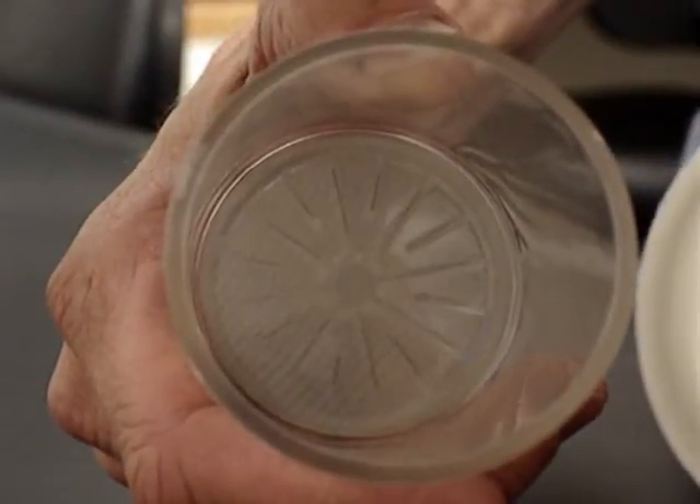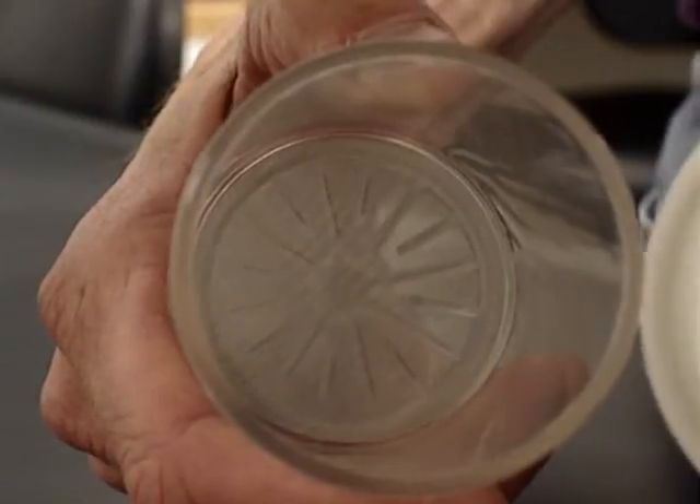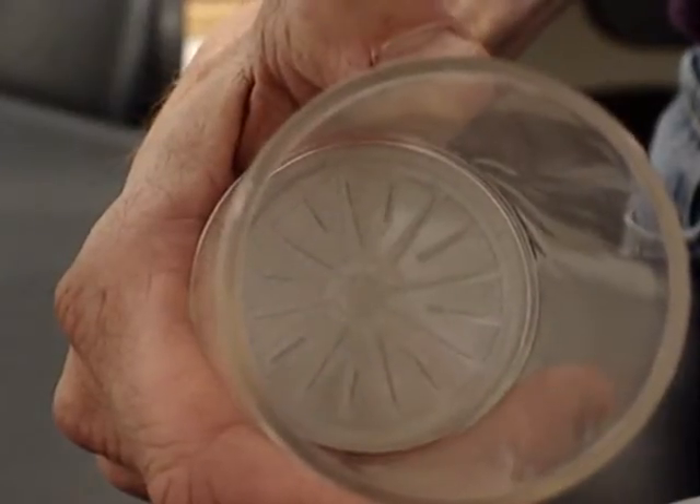Another high quality feature about the AgTech Zona filter is the introduction of our stainless steel screen. It's a very high quality screen, superior to the nylon screen used in many other filters.